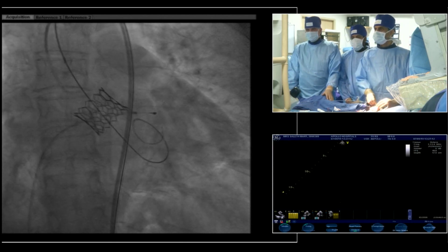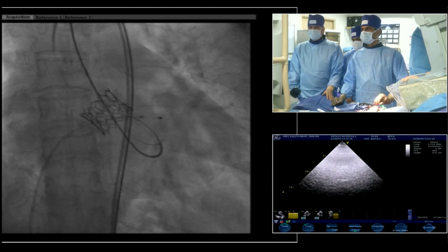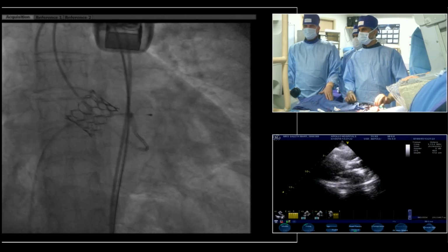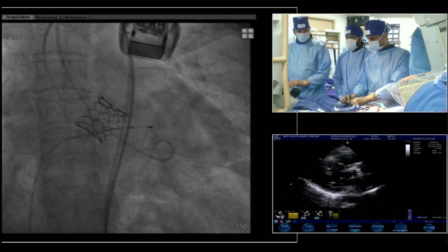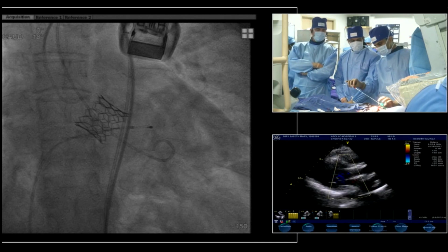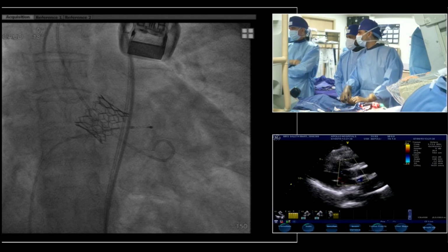Just here, the gradient, just look at the valve long axis. Yes, for them to see. So do you have any question in the room? Yes. Yeah, reduce the gain, color. It's bleeding too much, huh? It's bleeding. I think that's why echo is the best. Okay, the valve is bleeding, so we cannot. Can you check? Okay, I think we are fine.